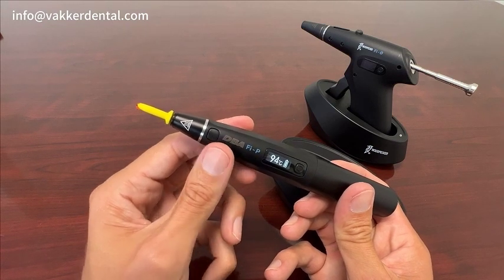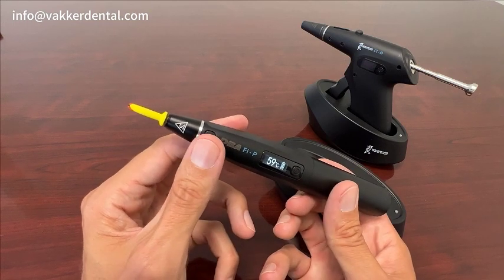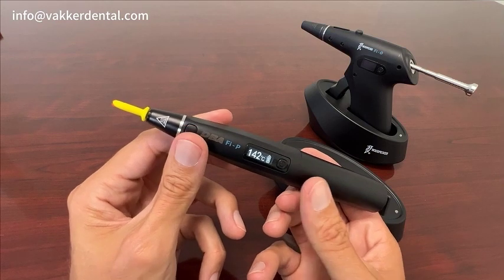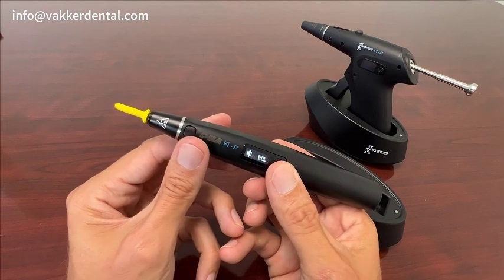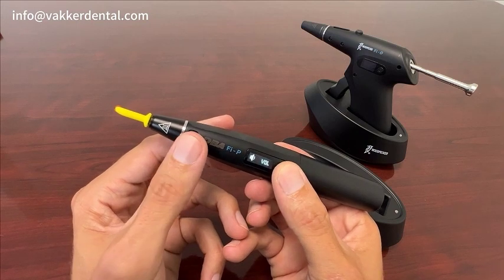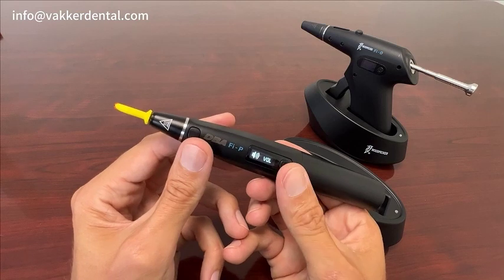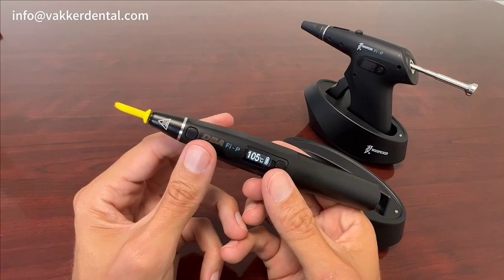One other thing I want to show you — notice how you can hear the sound of the beeping. If that's too loud, you can press the power button and then adjust it. I thought that was a pretty neat feature.